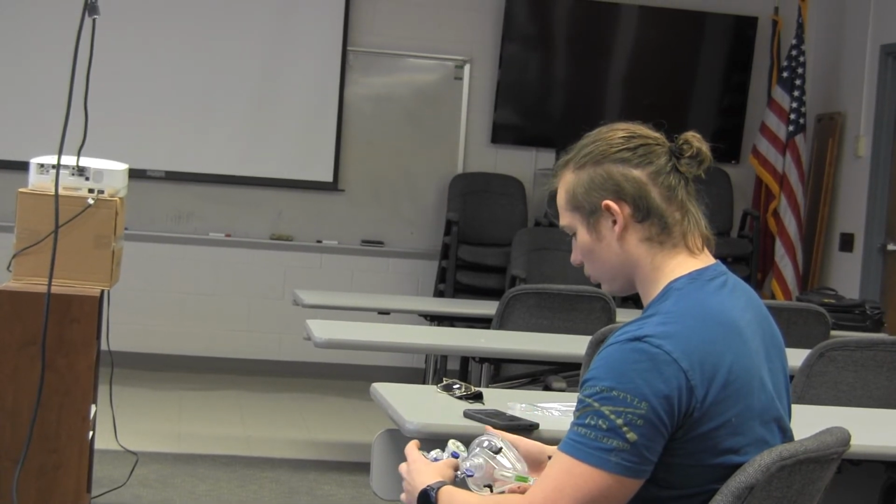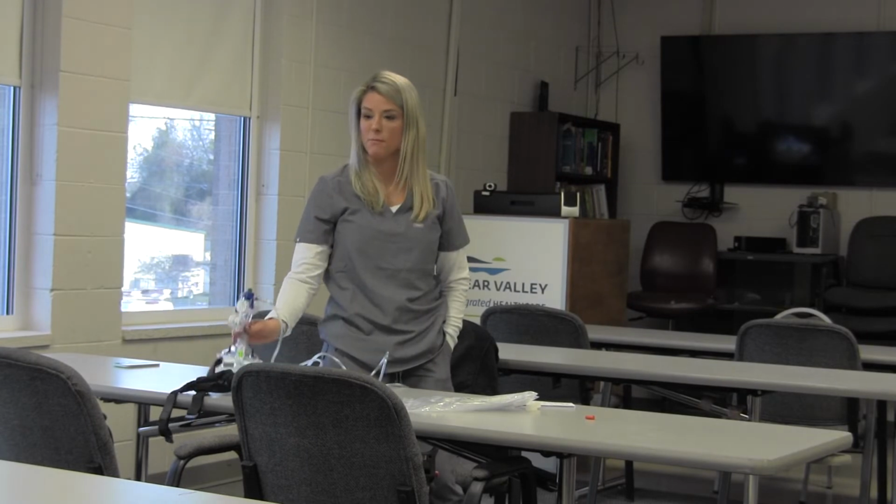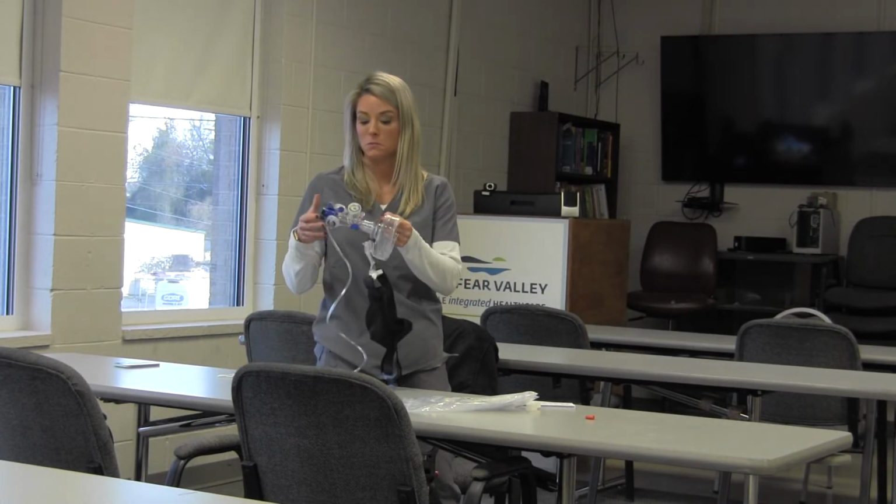So now we're gonna attach the DuoNeb to it, or a nebulizer. Yeah, you wanna do that? I just need a standard T-piece fitting. Remember, it has to be in a CPAP mode to do that.